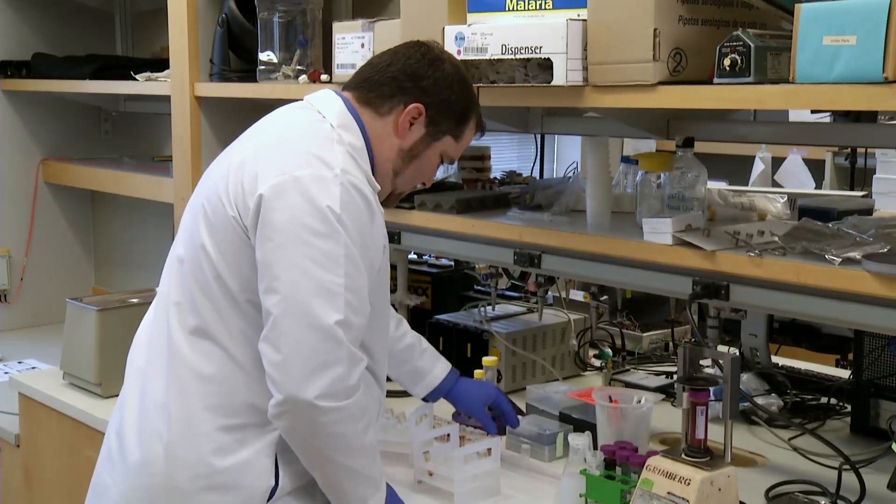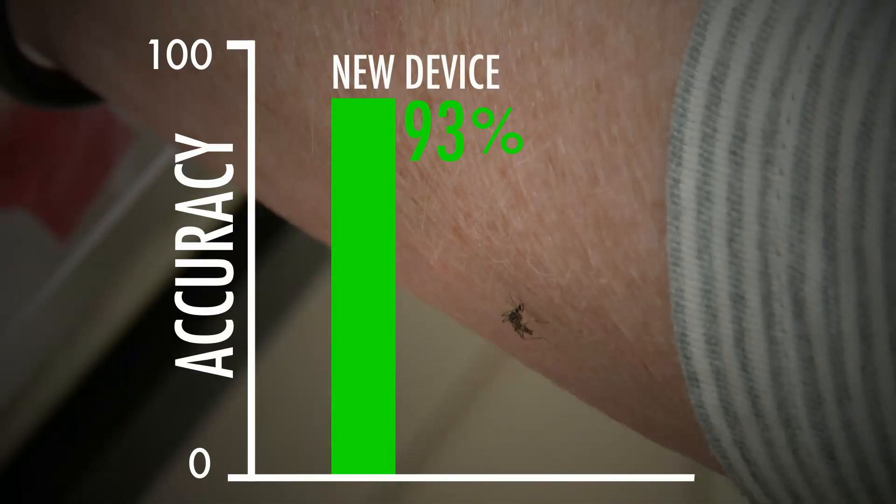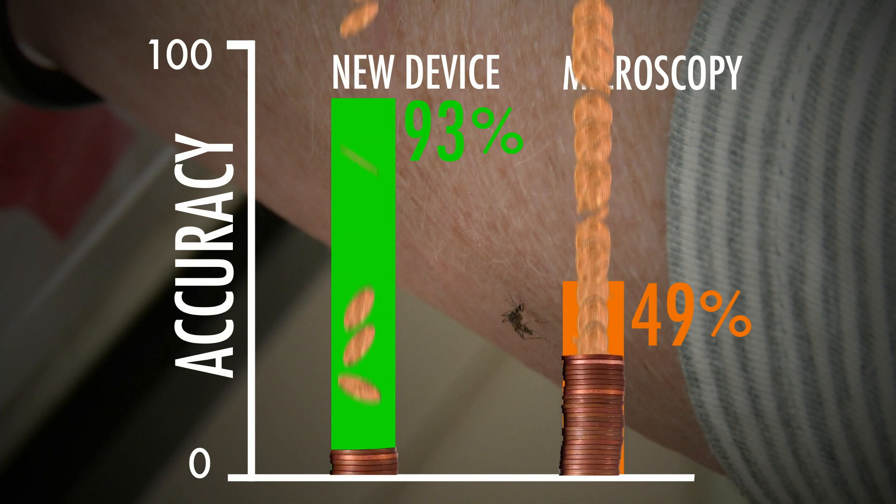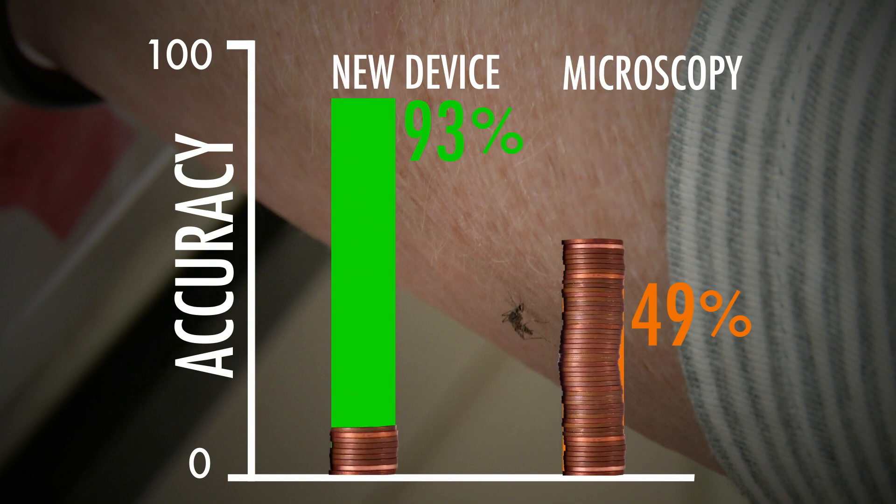The researchers tested the device in the field and found it was 93% accurate at spotting malaria. The traditional method, known as microscopy, was just 49% accurate. The new magnetic device costs only $0.09 per test, compared to about $0.50 for the traditional test.